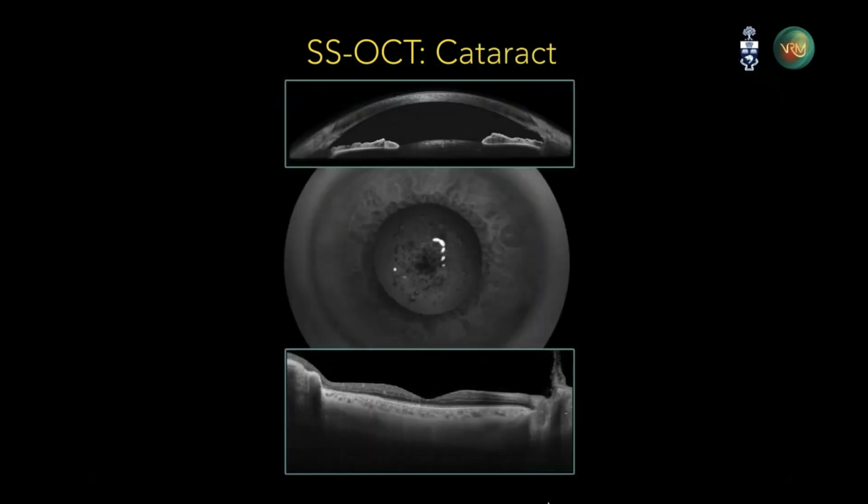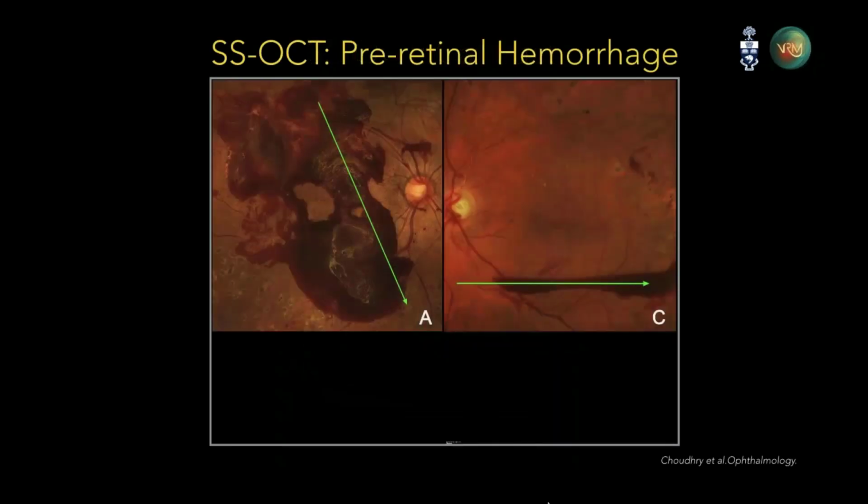Here's another example of a patient with a bad anterior subcapsular cataract, and you can see up top is the image from the anterior segment lens, and you can appreciate that the cataract is densest sort of towards the anterior or the iris plane. And the infrared image is obviously in the middle, and then you can see obviously the retina looks clear. So, no matter how the eye tries to impede, the Triton seems to prevail. So really, really nice for the physician and ultimately benefiting the patient's care.